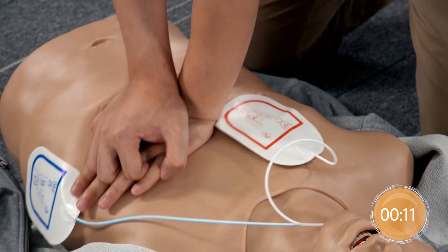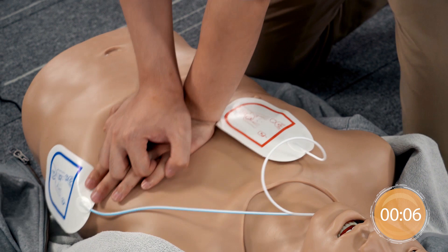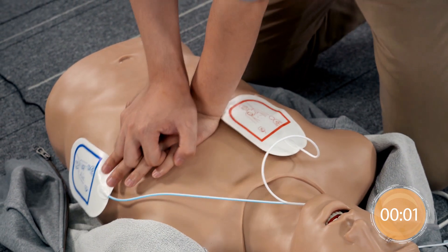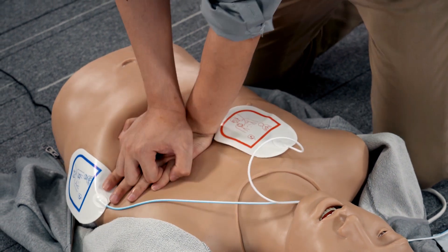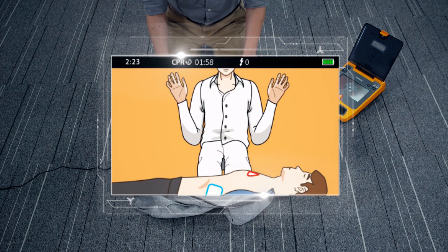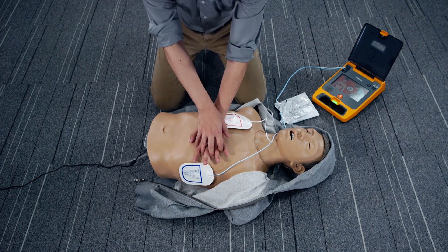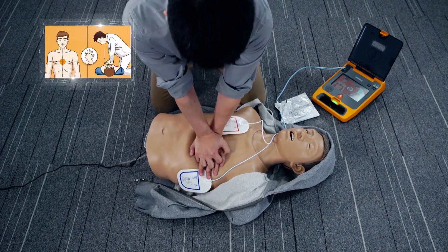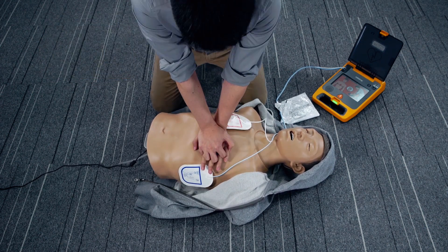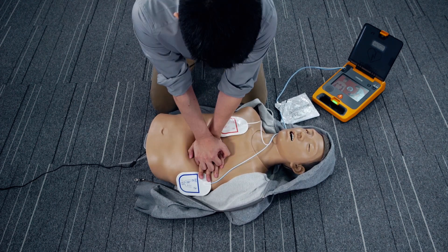20 compressions remaining. Push down hard. Stop CPR. Do not touch the patient. Analyzing heart rhythm. No shock advised. Start CPR immediately. Follow the metronome to give 200 compressions approximately.